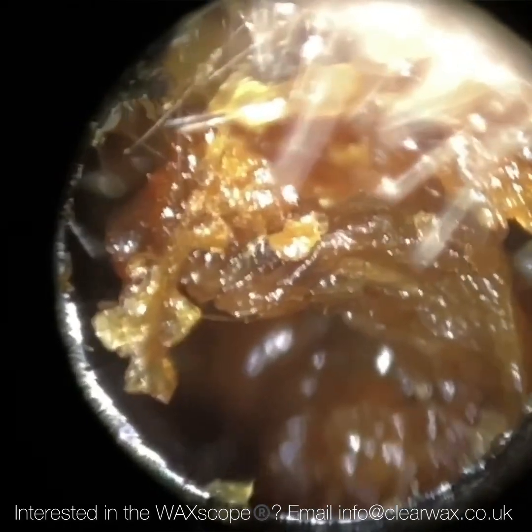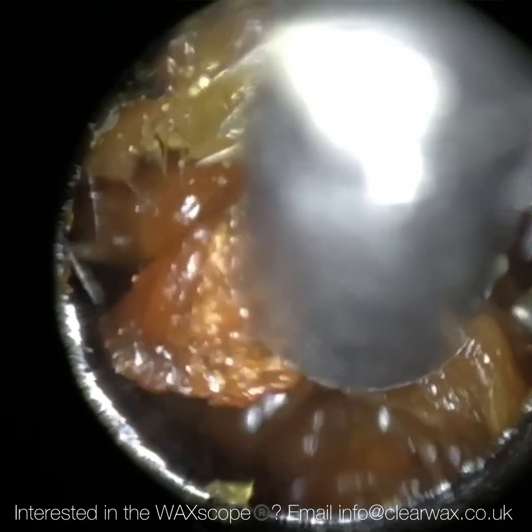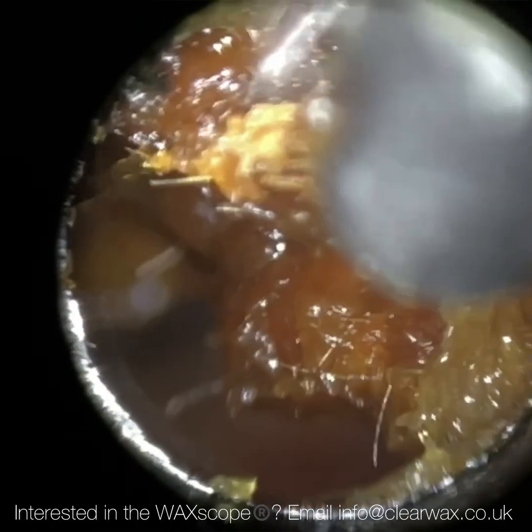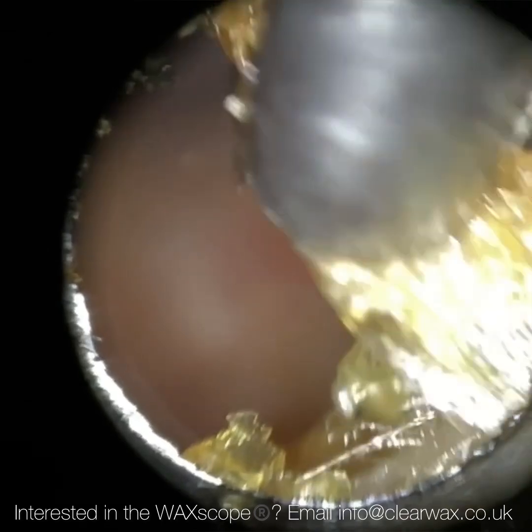So to clear the right side, just concentrate on the left. I'm using the medium size speculum. This is a 4.25 millimeter. We've got a smaller one, a 3.5 millimeter, and two larger ones.